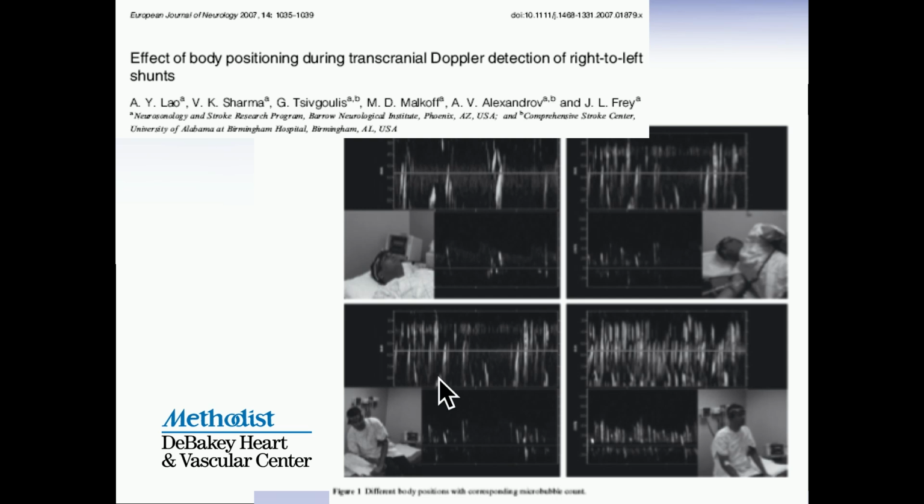This is why bending over is never a good idea. But when you're just simply sitting, you look at the difference. While you're sitting, you have a shower of emboli. Hard to believe that this is the difference between these 2 studies, just the body position. So suddenly the body position is extremely important, and I guess one of the reasons why we like to do the echoes while the patient is laying down is that you're not going to see too many of those bubbles.